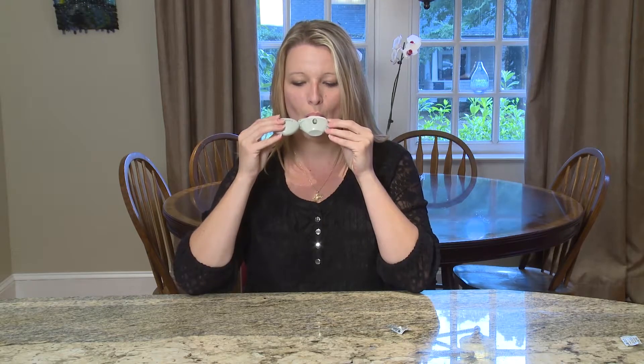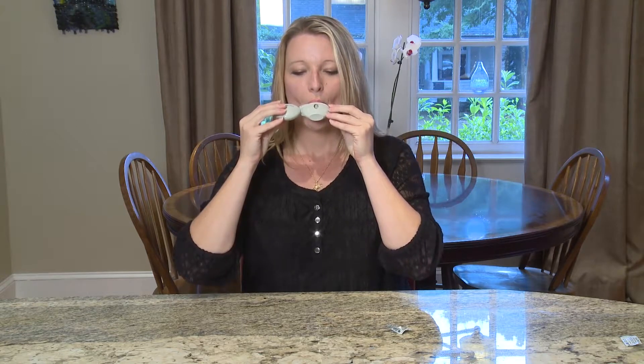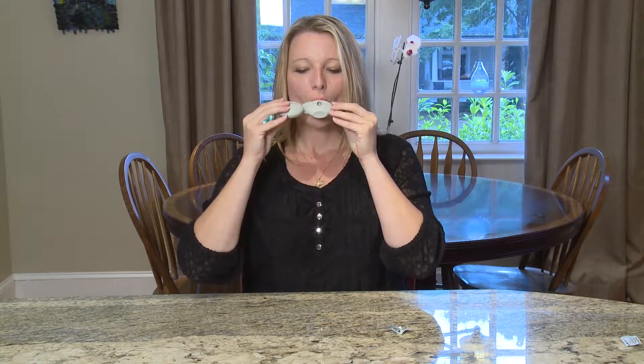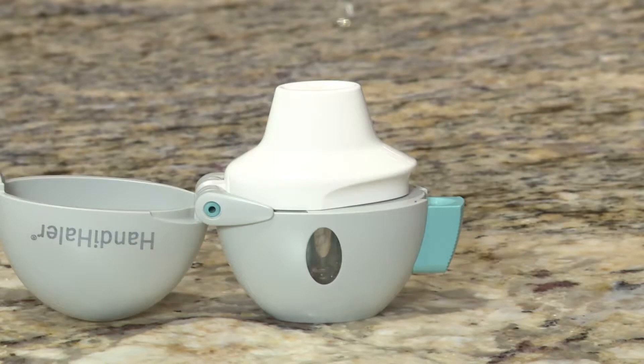Many people have trouble breathing and need to take medicine to help them breathe better. Medicine for your lungs can be taken in several different ways. One way is by a Handihaler Dry Powder Inhaler, or Handihaler for short. A Handihaler lets you take medicine in a powder form. You must breathe in the dry powder medicine using the Handihaler. This video will show you how to use your Handihaler.